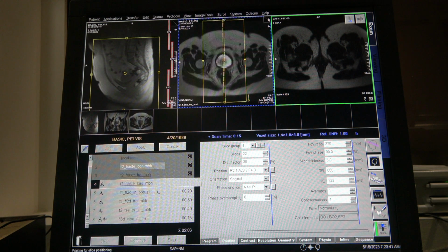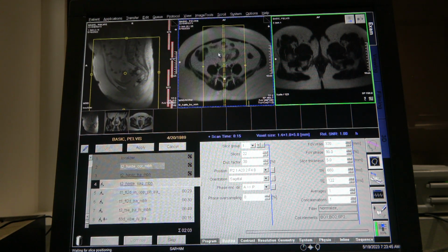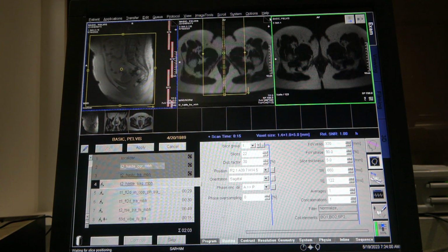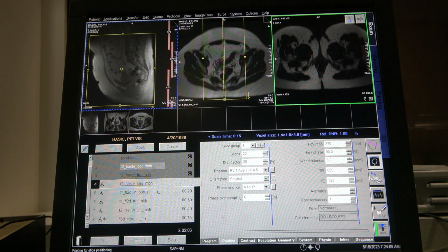Still breathing. All right. So, sagittal. This one just straight on. Okay, as you can see right here, this will overlap to this side. Okay, and let's go through this axial here. You can see that the backside, it looks like we're pretty good. Nothing's going over that.